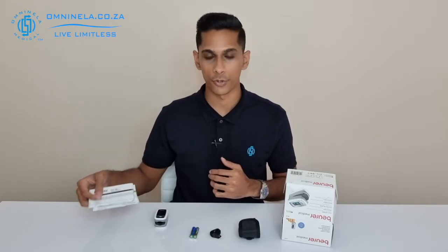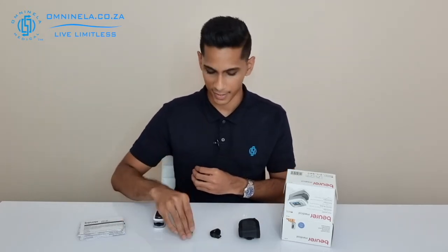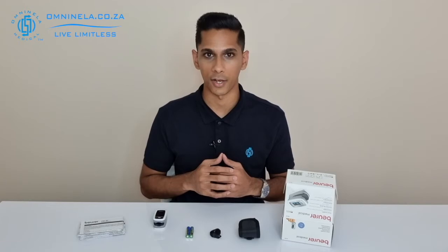It's always good to go through those so that you understand exactly how to use the device and also how to maintain it throughout its lifespan. We've also got the two triple-A batteries that come with it. If you are going to replace them, we'd always recommend an Energizer Max battery — it's got the best lifespan and also a good power output.